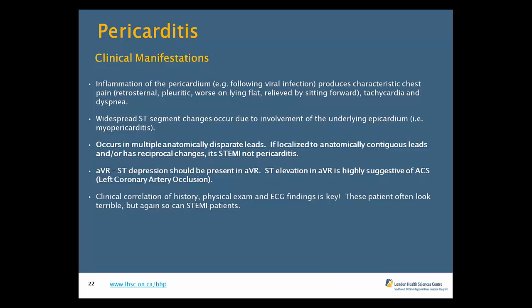So determining whether patients who have a pacer in situ are having an MI becomes very difficult, because their ST elevation is going to be masked by the underlying ST elevation from their pacemaker. As Mike alluded to, there are certain criteria that you can put into place, known as the Sgarbossa criteria, to help differentiate benign, meaning non-worrisome, ST elevation in these patients versus worrisome ST elevation. This goes beyond the scope of what is expected, but if you do want to take it to that next level, I encourage you to go out and read about Sgarbossa's criteria and be able to determine potential ECG changes that are indicative of STEMI in the presence of left bundle branch block.